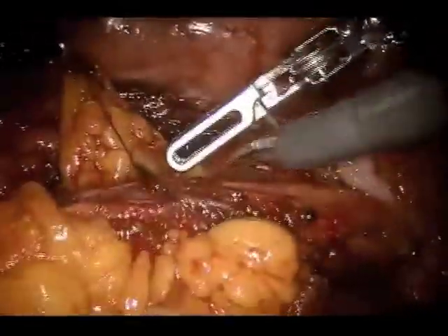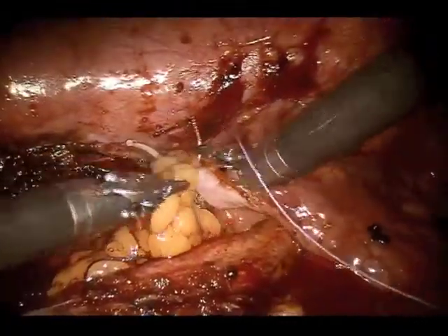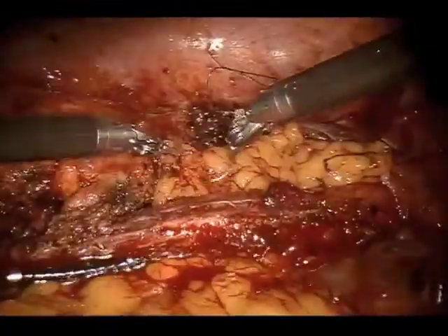The omental flap was sutured onto the psoas muscle under the ureter in preparation for a dorsal onlay of the buccal graft.